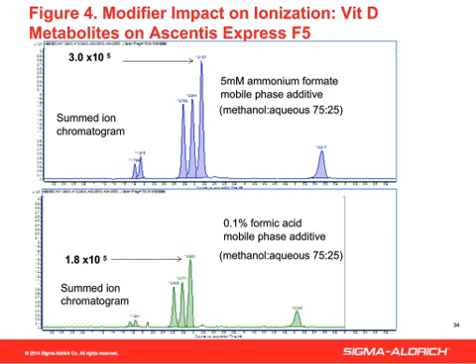Now, all these assays were conducted under ESI, positive ionization mode, and this was on a time-of-flight mass spectrometer. So we wanted to see what impact the buffer or the acid would have on response. And what we can see here is that regardless of the modifier, there really isn't a change in selectivity on the vitamin D metabolites using the different modifiers. And that's kind of to be expected.